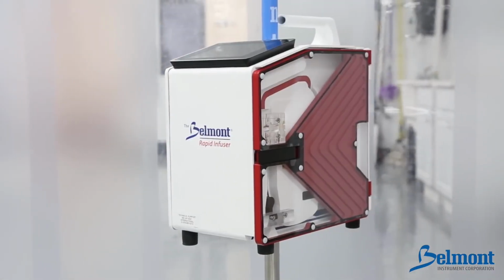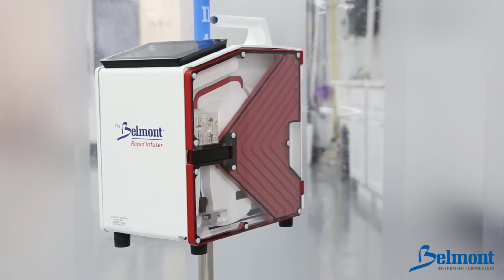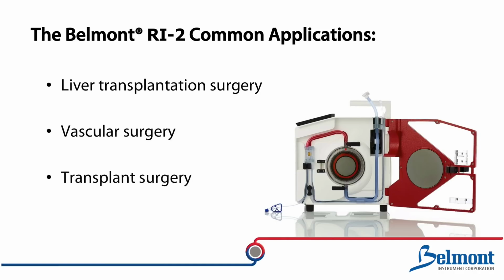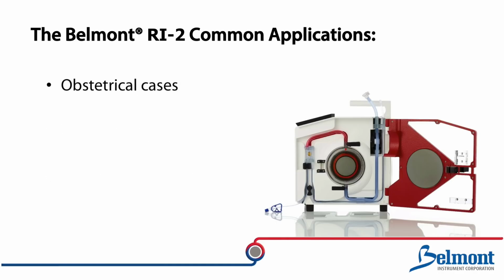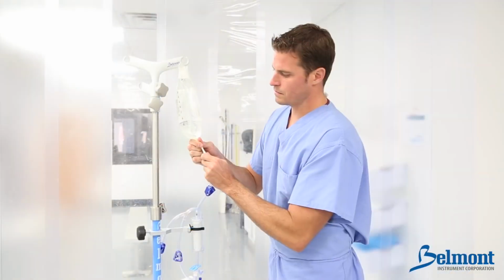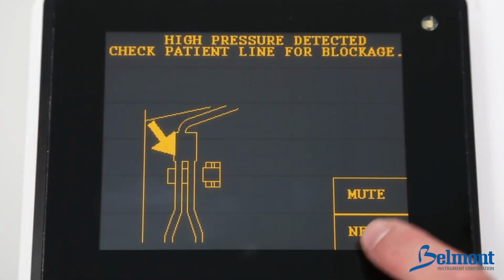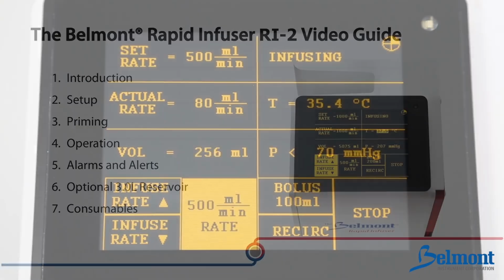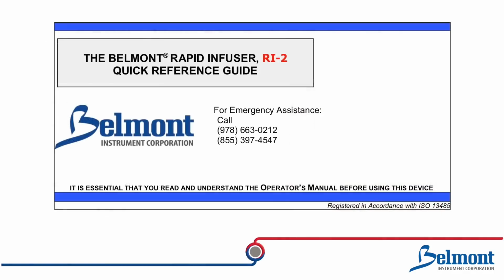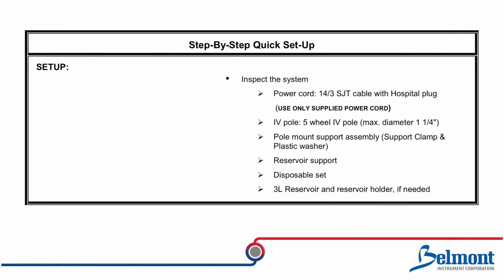The Belmont Rapid Infuser RI-2 is a self-contained fluid management system. Common applications include liver transplantation surgery, vascular surgery, transplant surgery, complicated obstetrical cases, aneurysm repairs, and trauma. In this series of videos, you will learn how to install, operate, and troubleshoot your Belmont Rapid Infuser RI-2. Watch all the videos or navigate to the specific topics you're interested in. You can also find detailed information in your operator's manual as well as quick reference guides.